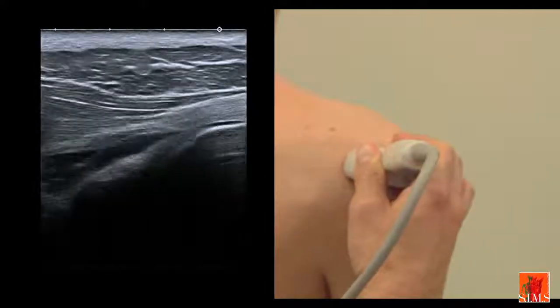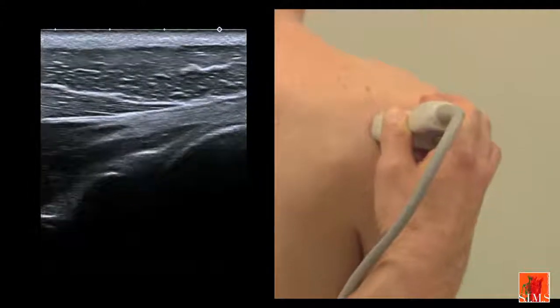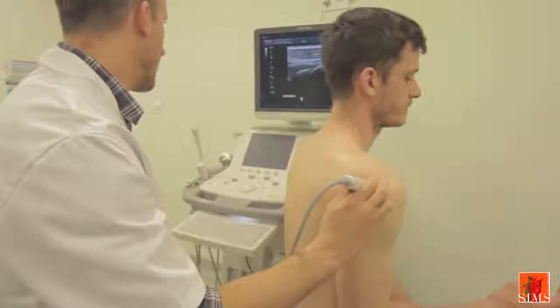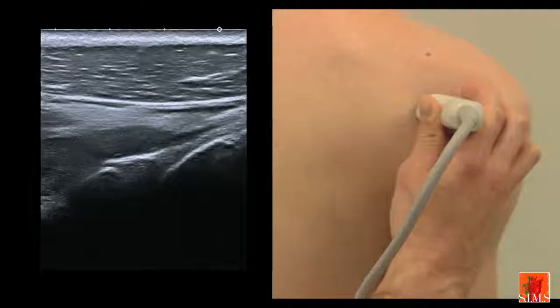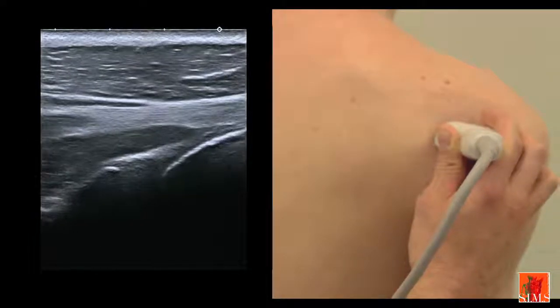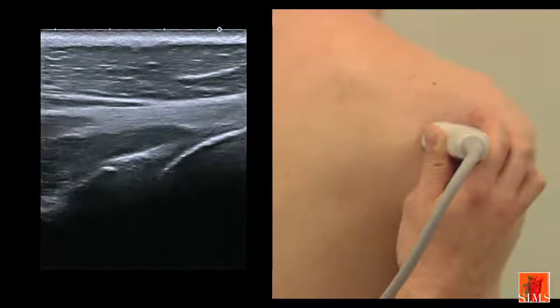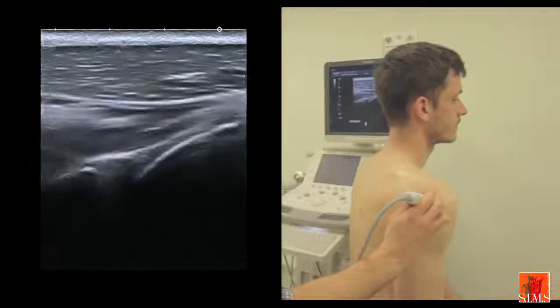In depth we note the existence of the joint and of a hyperechogenic triangular labrum which we can see here. When this horizontal view of the posterior glenohumeral joint is performed in neutral rotation or medial rotation, the infraspinatus tendon is flattened against the joint. In order to achieve a more sensitive detection of an effusion, we can ask the patient to perform external rotations that relax the infraspinatus and the joint capsule.